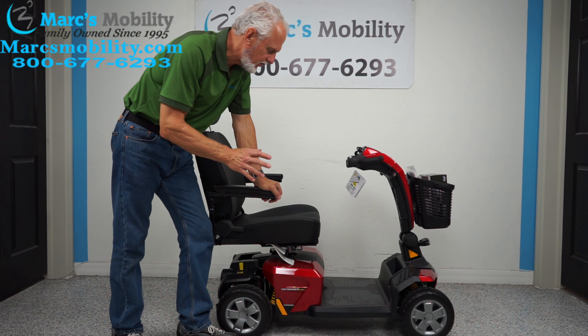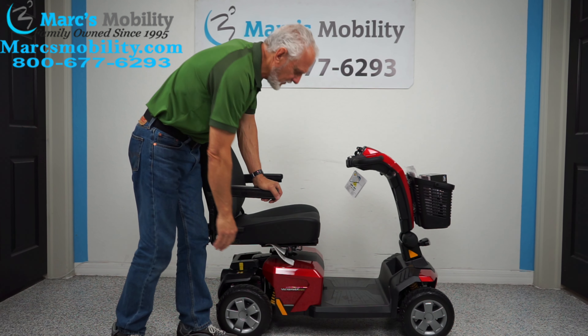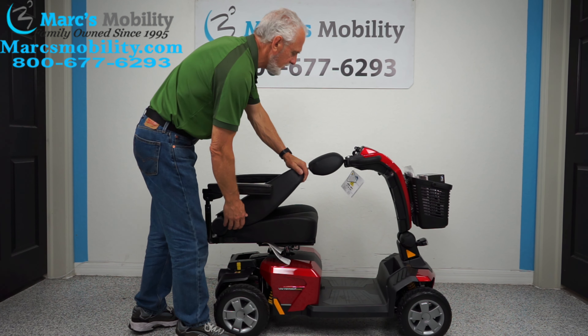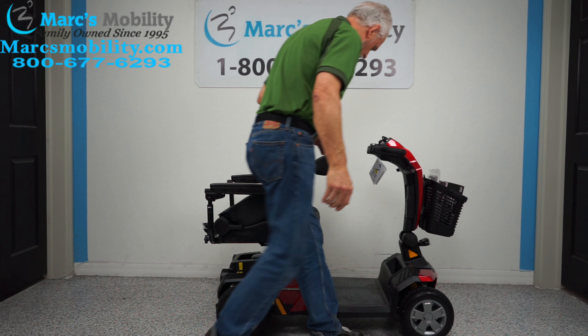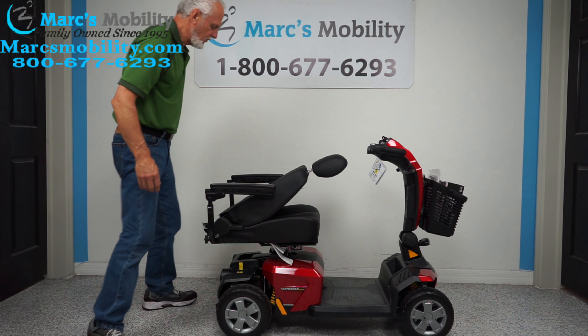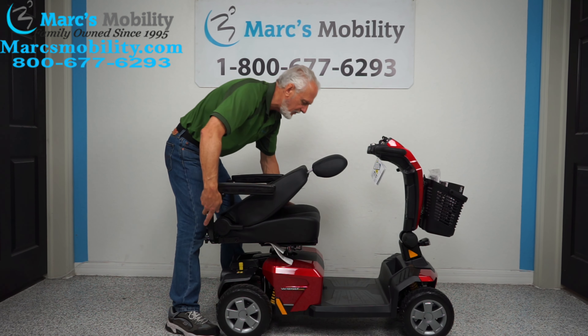The first thing you're going to want to do if you're going to change the battery — we have to take the seat off because the batteries are right here. Fold the seat all the way down, get the tiller out of the way, fold the seat all the way down. When you grab the seat, you raise straight up — don't pull back, it's got to come straight up.